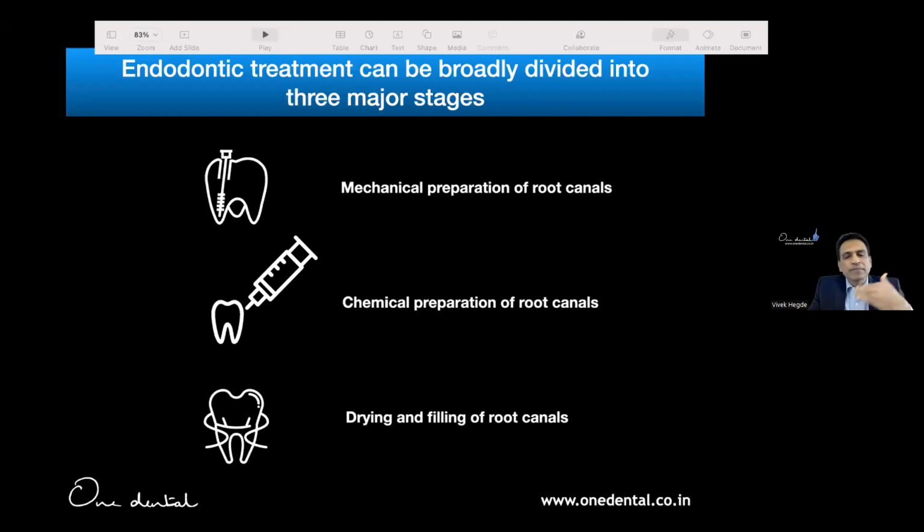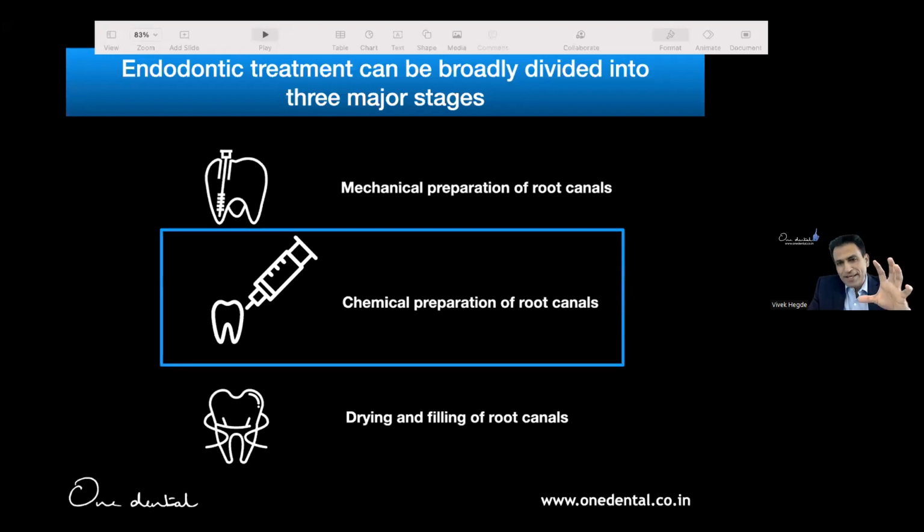So these three become a major part, of which the most important part is the middle one, where we have to disinfect the root canal system. Unfortunately, around the world, this is one step many of us are short on. We're short of job when it comes to cleaning the system. Let's see what has happened and why and all those things.